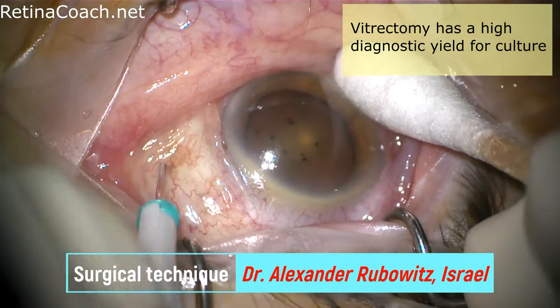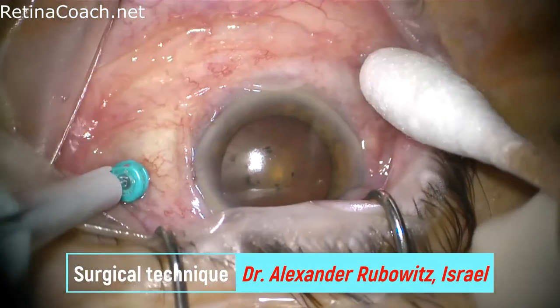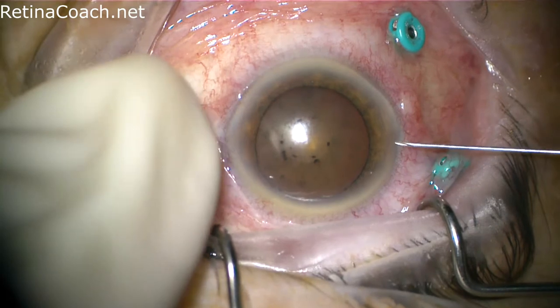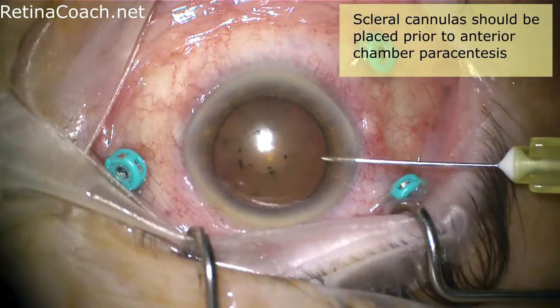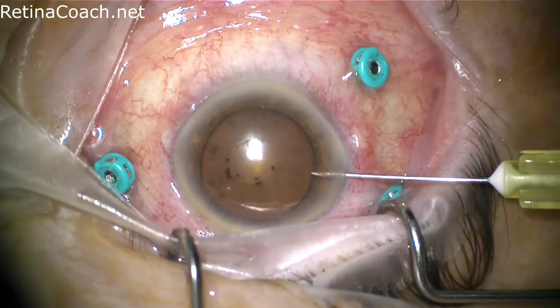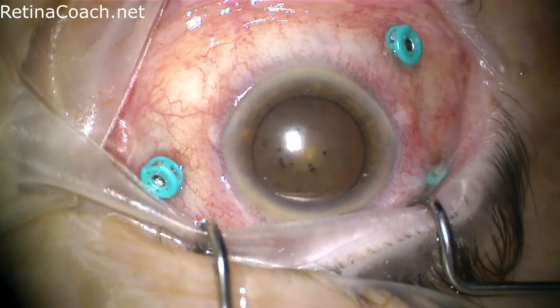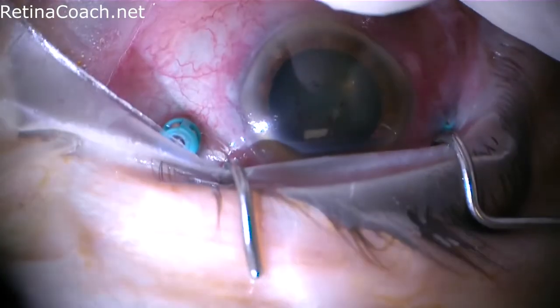Prior to surgery, it is important to communicate with the lab to determine its preferences for specimen processing and handling, and also prepare the tubes for material collection. In case when an anterior chamber tap is planned in addition to vitreous biopsy, scleral cannulas should be placed prior to it, as anterior chamber paracentesis causes hypotony and insertion of cannulas in the soft eye is quite challenging.